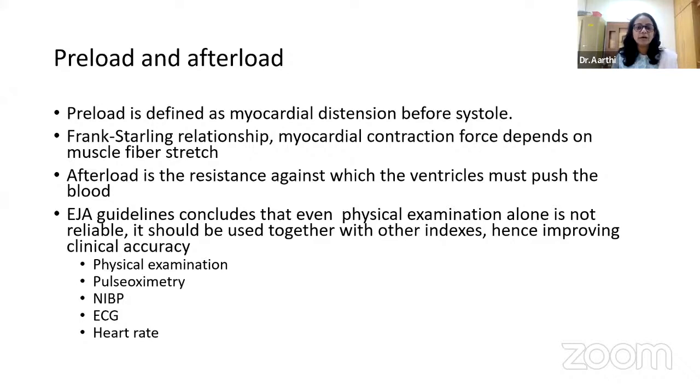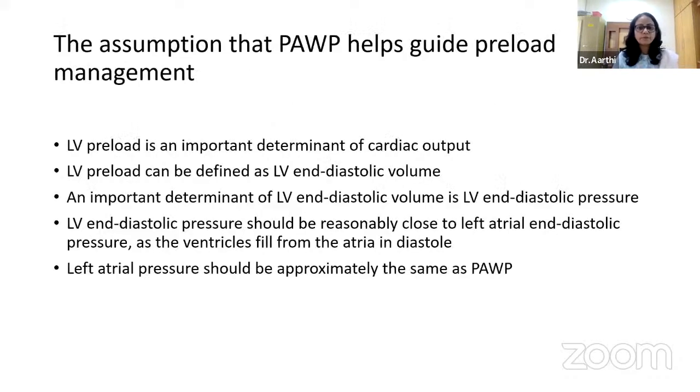Preload is defined as the myocardial distension before systole, and with respect to the Frank-Starling relationship, the myocardial contraction force depends upon the muscle fiber stretch, which is exactly the preload. And afterload is the resistance against which the ventricles must push the blood. And the European guidelines suggest that apart from the clinical assessment, all these parameters should be guided with the physical examination, with the basic monitoring devices, and along with the advanced hemodynamic monitoring devices.